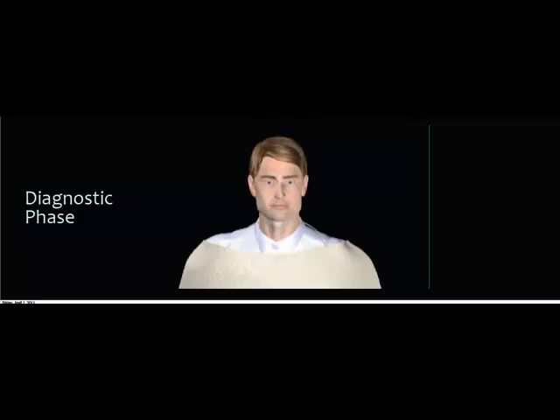So here's our typical patient. The patient comes in, they're not very happy with their smile, they can't even smile if they wanted to, their teeth are mobile, they're not really able to function. We want to start off with very good impressions. The impressions are equivalent to if you're going to do an immediate denture. You need to capture the soft tissue and the vestibular area as best as we can.